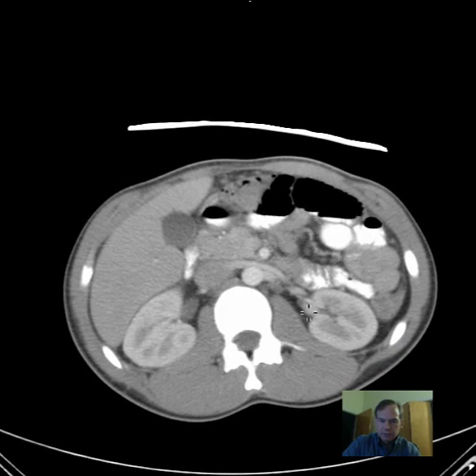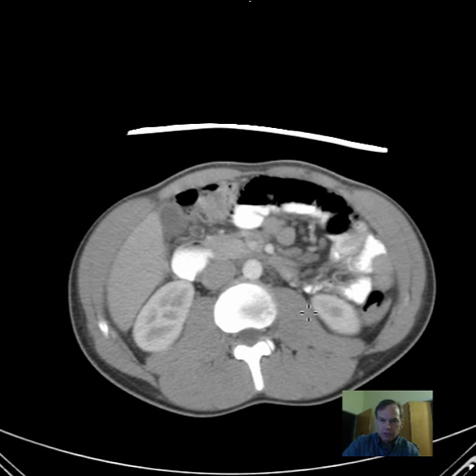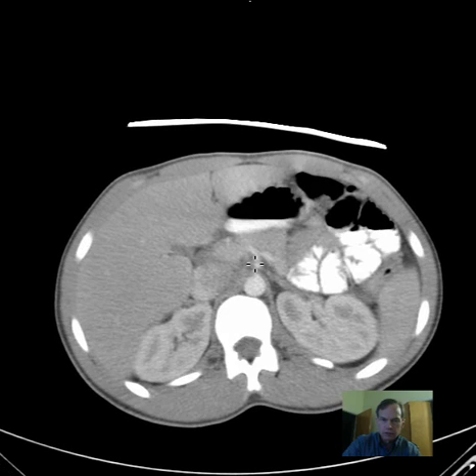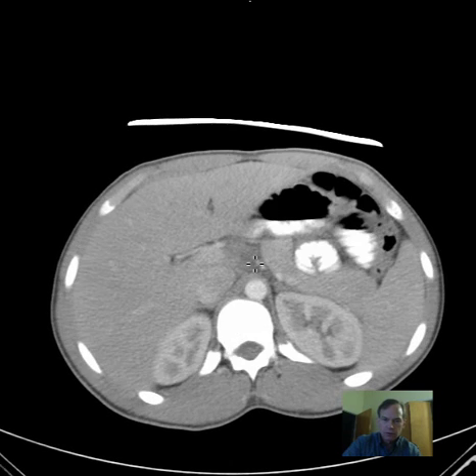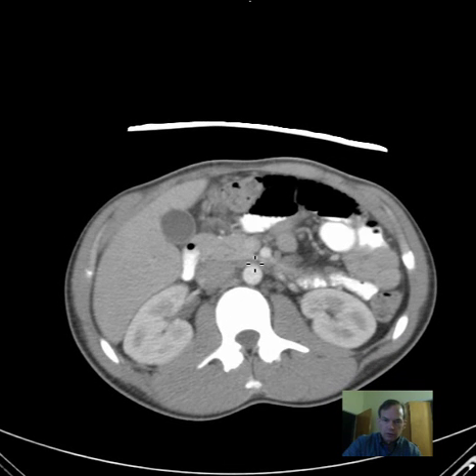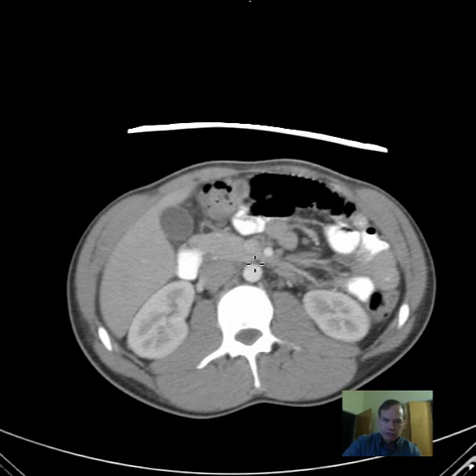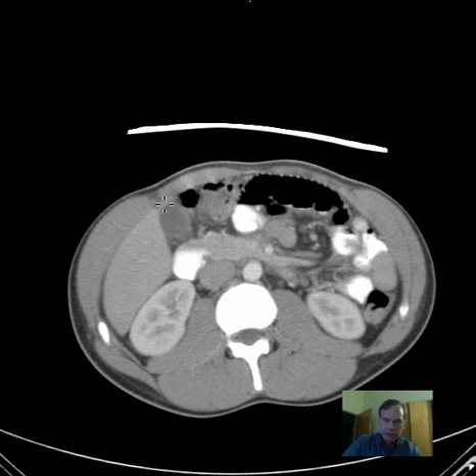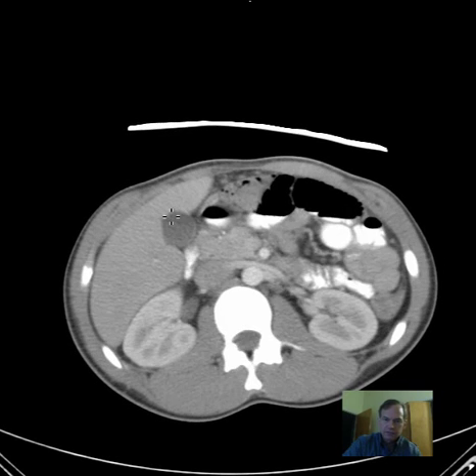The kidneys appear unremarkable. The abdominal aorta is normal in caliber. No obvious gallbladder abnormalities are identified.